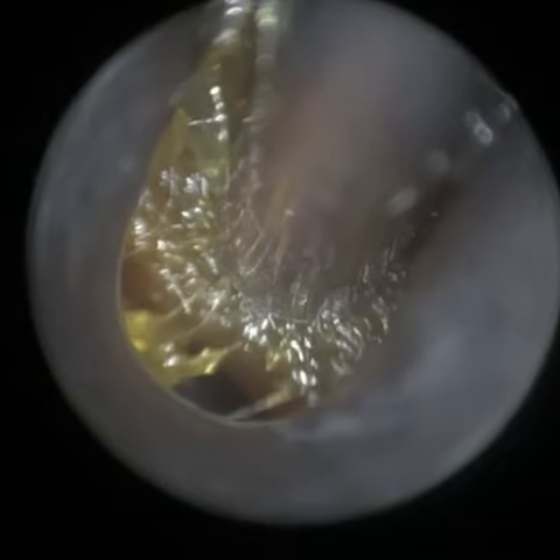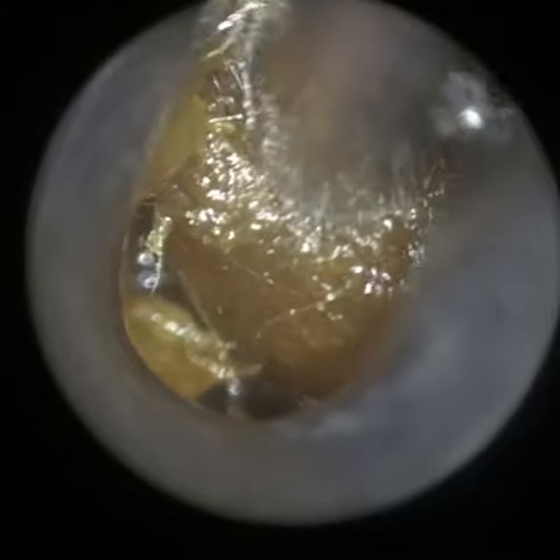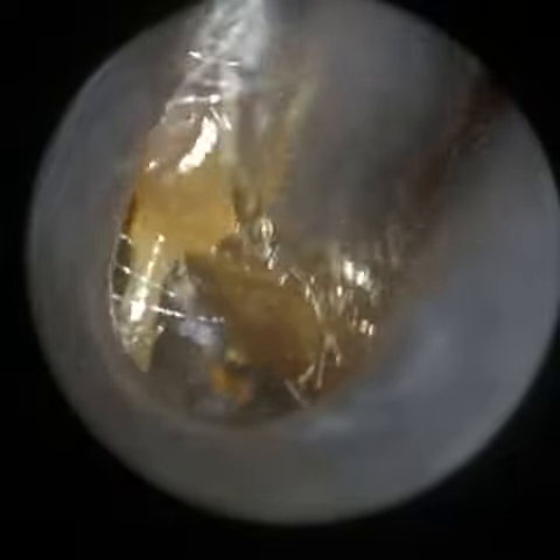You can see the technique I'm adopting here. I'm using the microsuction probe just to detach and loosen the wax plug off the canal wall. Here it's actually lodged beyond the isthmus. An isthmus is a narrowing of the ear canal — or narrowing of any part of the body, actually — that's the medical definition. Within the ear, you have an isthmus between the first and second bend, and also around half a centimetre away from the eardrum, where the ear canal narrows and then expands and widens again. So I'm just trying to wriggle this through.